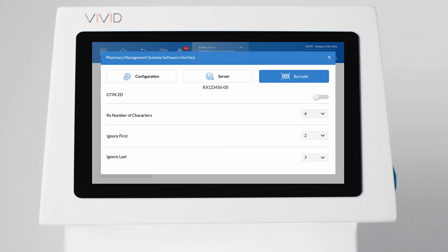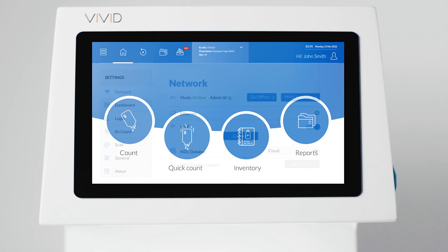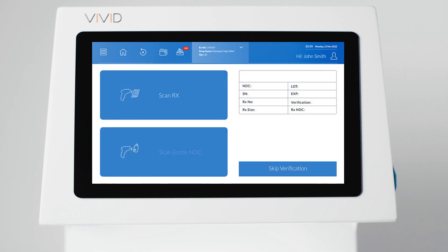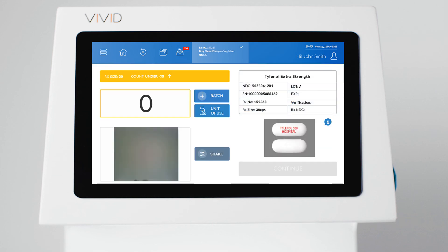To count a transaction that was sent to the Vivid, simply select Count from the dashboard and scan the Rx label. You're all set. Your interface configuration is finished.